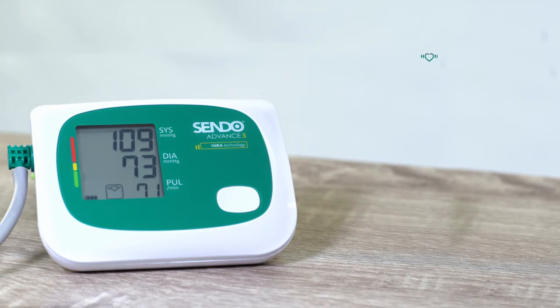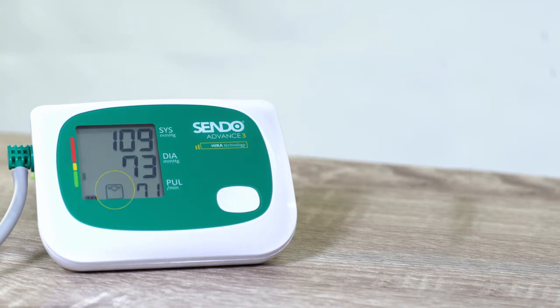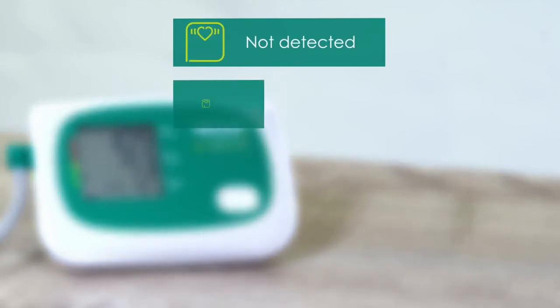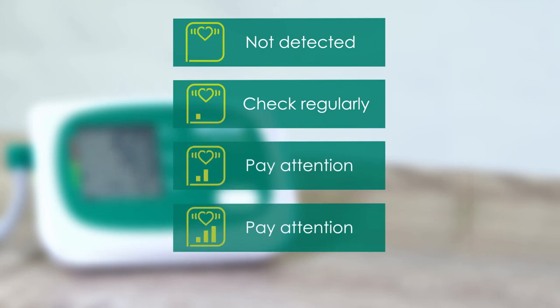Special heart technology detects any irregular heartbeat during measurements. After the first 7 measurements, the heart technology will analyse your irregular heartbeat and classify it according to severity, to show one of the 4 status icons.